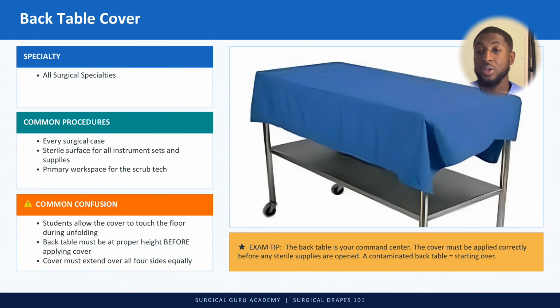Okay, it's a sterile surface for all of your instruments and supplies, and it's your primary workspace as a surgical tech. Students allow the cover to touch the floor during unfolding. That is a mistake that you want to avoid. The back table must be at the appropriate height before applying the cover.